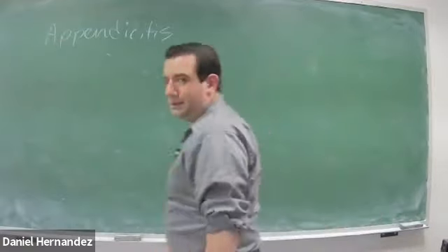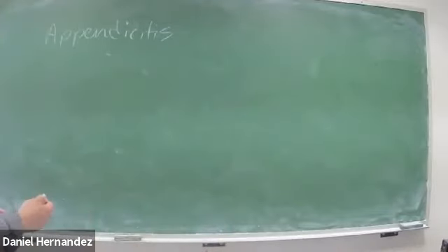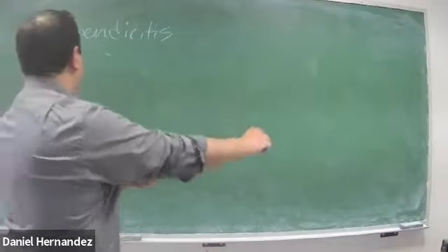So with appendicitis, what's the sonographic presentation? What's it going to look like on ultrasound?